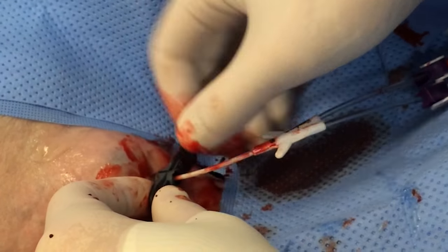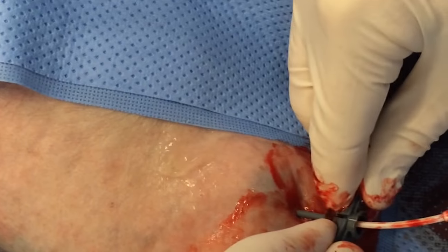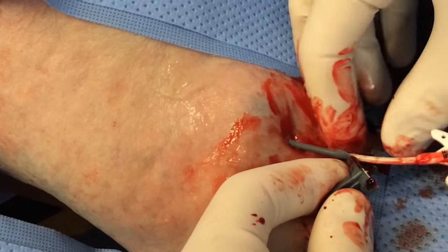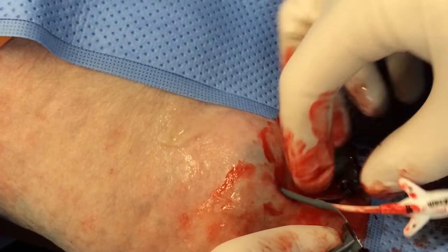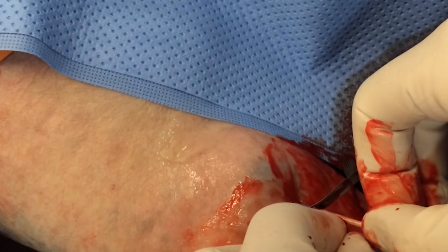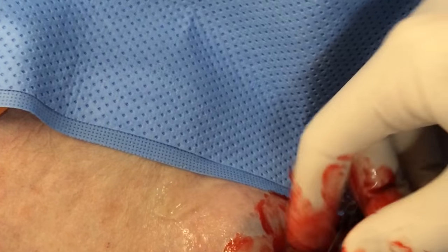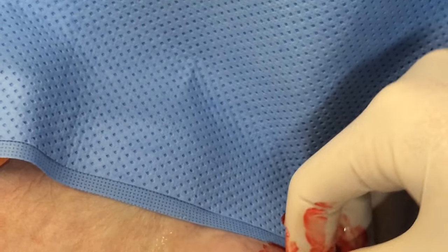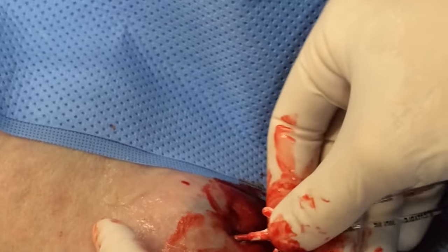That's the right amount to have out — about three to four inches. You'll pull back on the dilator and then just crack it and it'll split in half. Then you're going to pull it down until you're near the skin, but not at the skin — you don't want this breaking apart inside the skin. You keep pulling it out over the midline itself: pull it out, break, pull it out, break. Final break is done. Now you can hub the midline.